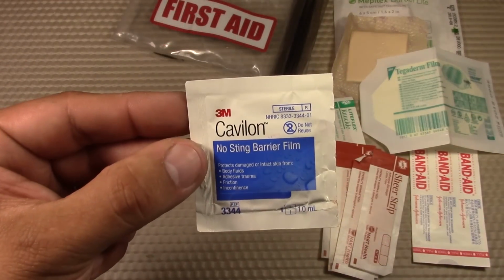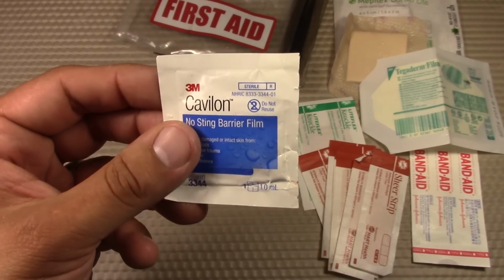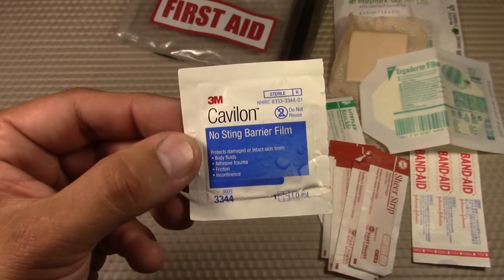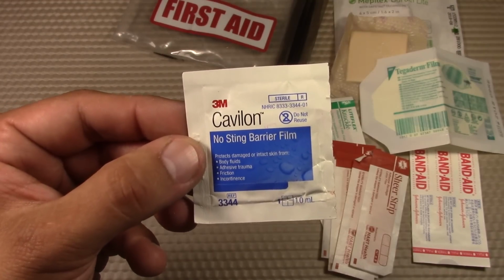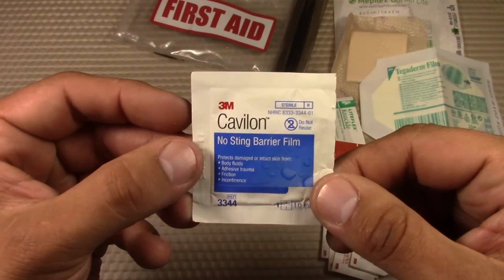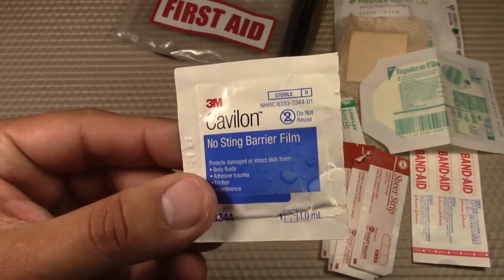Next, I have a single 3M Cavilon no sting barrier. This is basically a sting-free, alcohol-free, liquid barrier film that dries really quickly over a wound, and it provides a breathable, transparent coating on the skin to help protect it. So I just have a single one of these. You could buy them by the box, and they work really nice. So some Cavilon no sting barrier film.